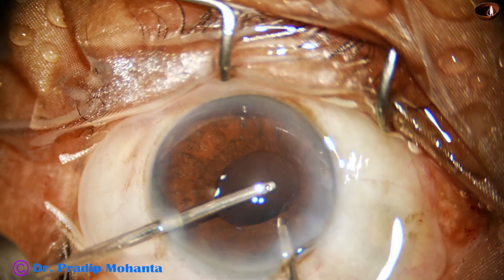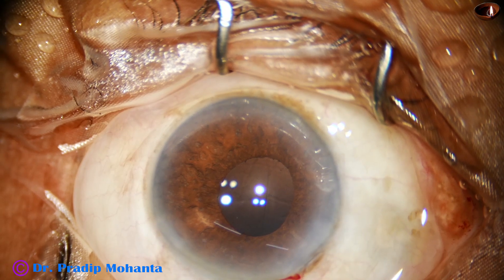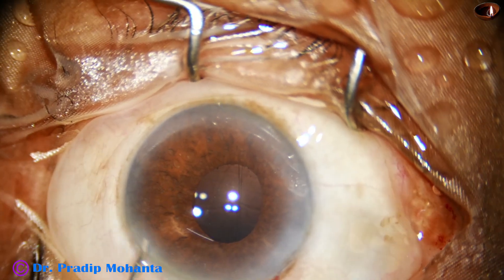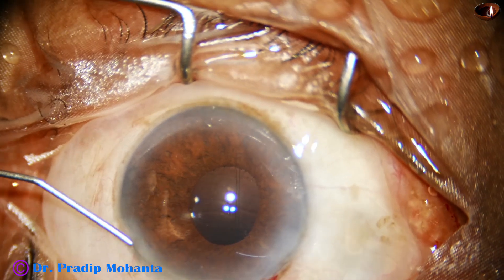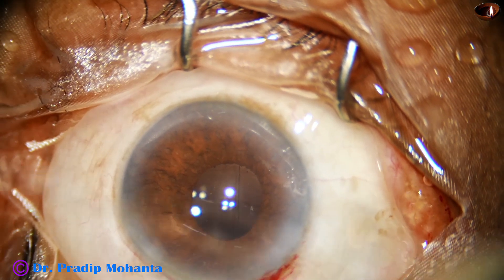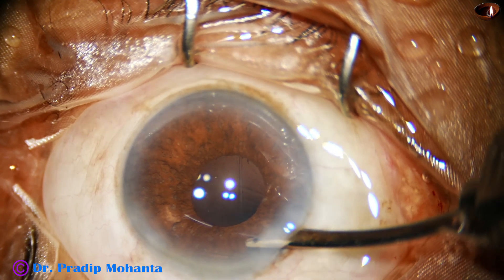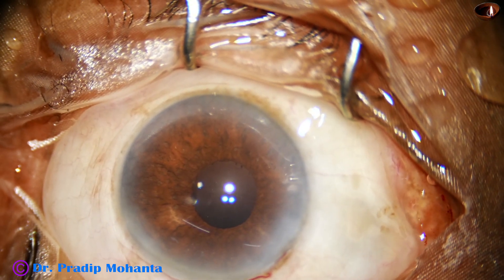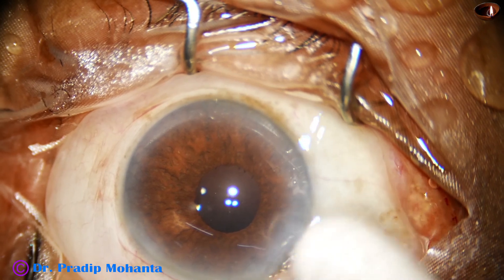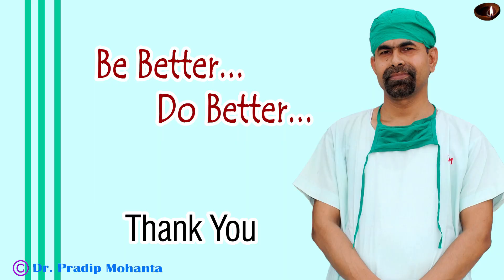Now this is removal of some more viscoelastic. When I am happy that all the viscoelastic has been removed, I inject moxifloxacin, hydrate the side port, close the side port, and then a final lavage is done to form the anterior chamber nicely. The pupil is round and there is no sphincter damage. The wounds are checked, moxifloxacin is applied over the ocular surface, and the case is concluded. Thank you very much for your attention. Hope you like this device and try the B-Octa pupil expansion ring.